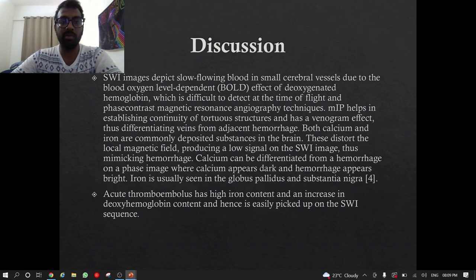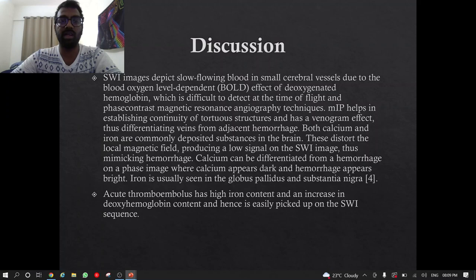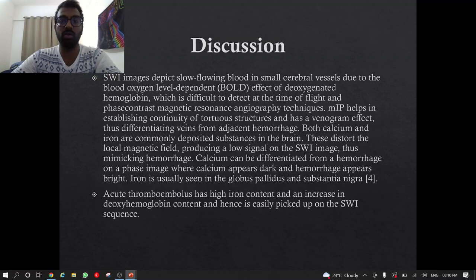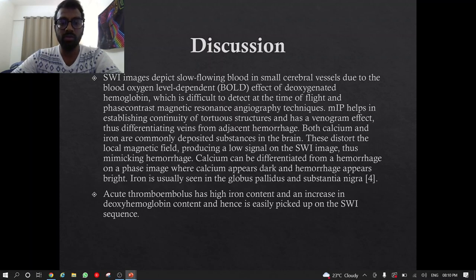In the discussion: SWI images slow-flowing blood in small cerebral vessels due to the blood oxygen level-dependent effect of deoxygenated hemoglobin, which is difficult to detect on time-of-flight and phase contrast MR angiographic techniques. MIP helps in establishing continuity of tortuous structures and has a venogram effect, differentiating veins from adjacent hemorrhage. Both calcium and iron are commonly deposited substances in the brain; these distort the local magnetic field, producing a low signal on SWI, thus mimicking hemorrhage. Calcium can be differentiated from hemorrhage on phase image — calcium appears dark and hemorrhage appears bright. Iron is usually seen in the globus pallidus and substantia nigra. Acute thromboembolism has high iron content and increased deoxyhemoglobin, and hence is easily picked up on SWI sequences.